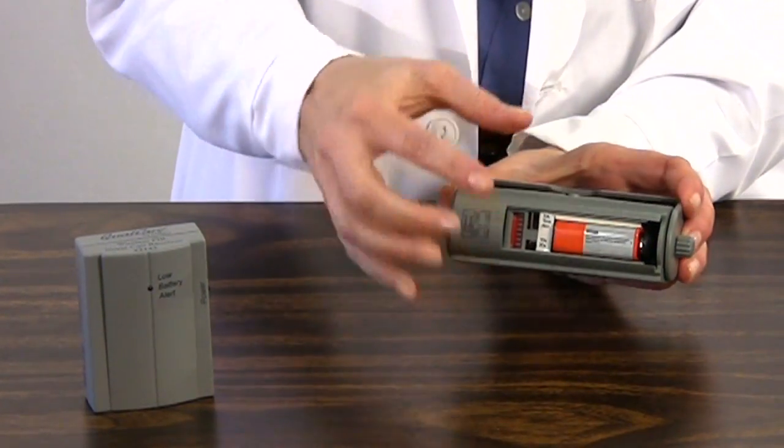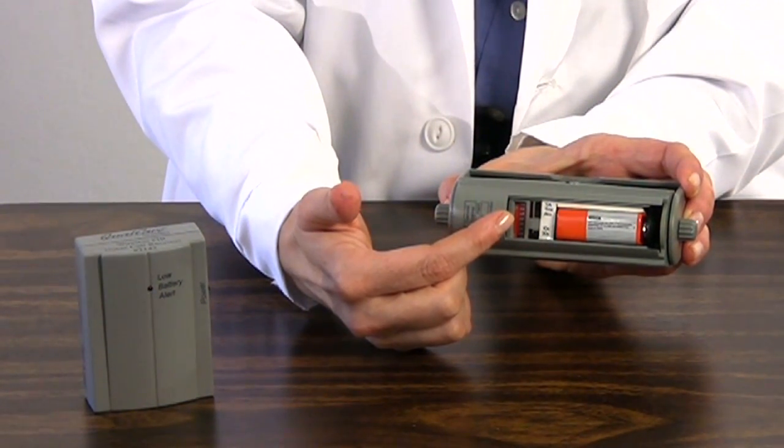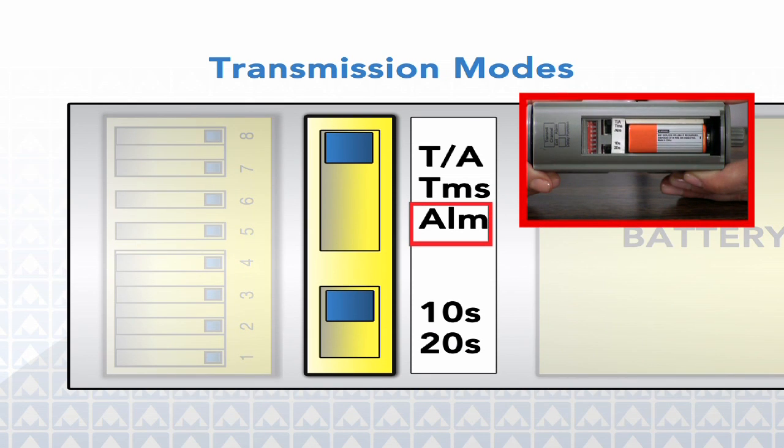Here you'll also find the transmission mode controls. Three choices can be made using the selector switch. Choose alarm if you want only the alarm to sound with no signal sent to any other devices — use this mode when using the PIR unit only. Choose transmit when you want the PIR alarm to transmit only to the nurse call receiver and not emit an alarm sound itself — use this mode when trying to avoid waking other patients in the room. Choose transmit and alarm if you want the PIR alarm to both alarm locally and transmit to the nurse call receiver, alerting staff at the nurse's station as well as warning the patient.